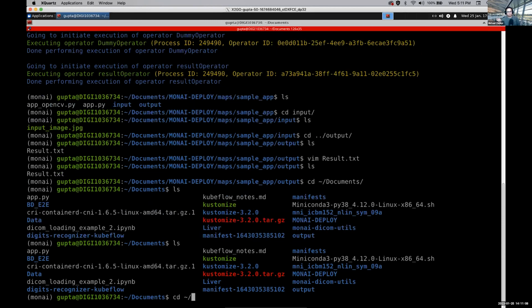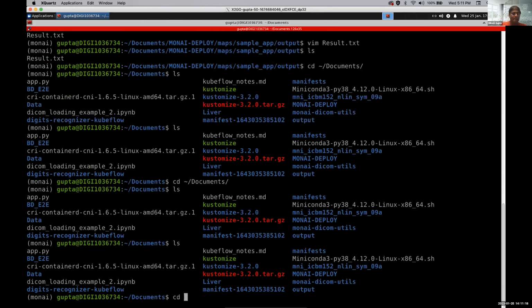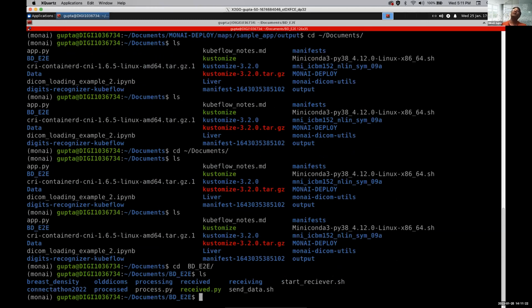Okay. And I know that you have the decorator classes on top of each of the operators as well, to dictate things like the amount of GPU and the amount of VRAM. All those sorts of things are included as options for resource constraining. Yeah. Nowadays there are so many GPUs and so much memory that it's not so much of a concern at this point. So I don't think of it now.